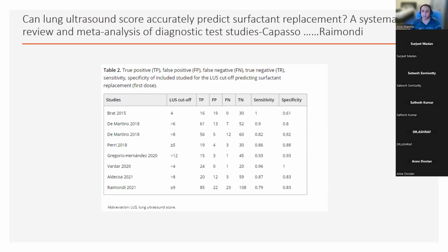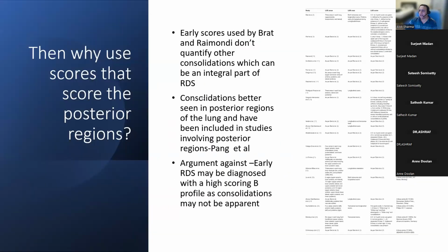This is really important because if you're doing serial scanning, and in particular serial scanning to determine whether you want to give the second dose, it's small things like a change in the probe or the frequency. It might be that somebody's using 15 and somebody's using 12. That will affect your interpretation and can result in a lot of confusion and, I would say, unnecessary therapy.